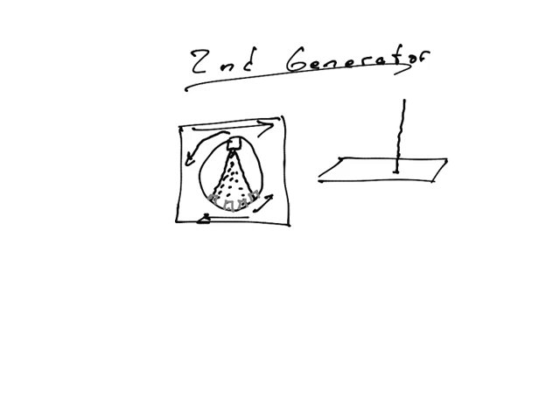So obviously, if you go across, you're only getting this line of stuff. With a fan beam like this, when you go across the object, you're getting all of this piece in each snapshot. So you get a lot more of the image per pass, and you don't have to take as long to create the same images as before.